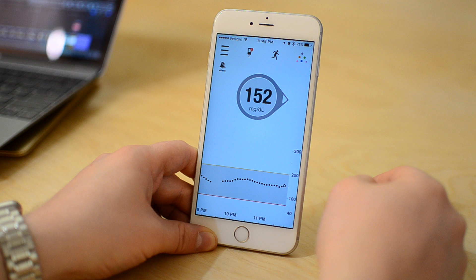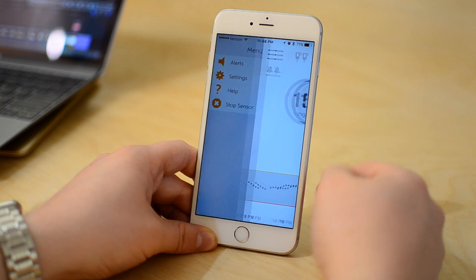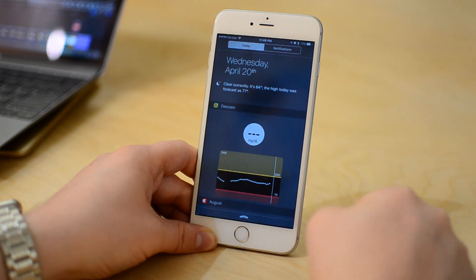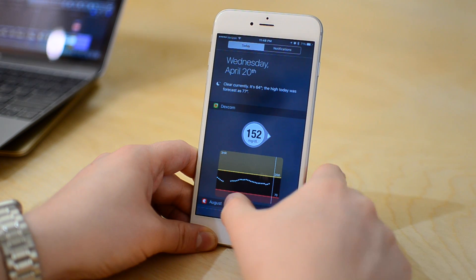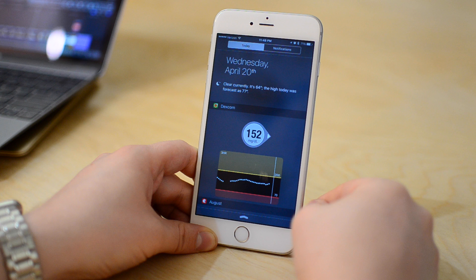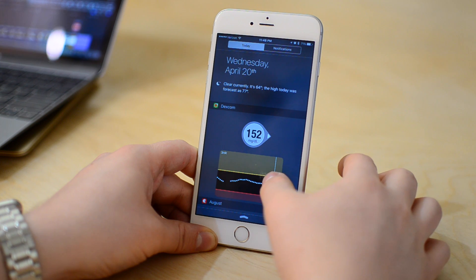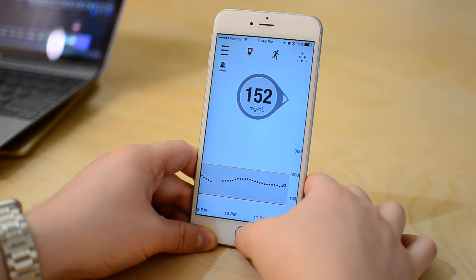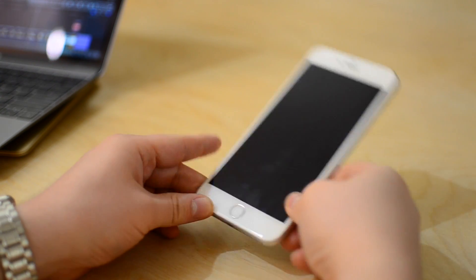But now in version 1.2.1 of the application and newer, they've added that as well as a few new features. The first new feature is the ability to see your blood sugar levels in your notification center. Swiping down from the top, you can add this little Dexcom widget and it'll give you your chart as well as your current blood sugar and where you're trending.